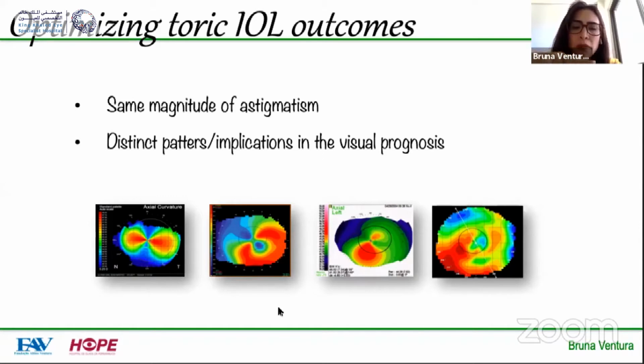We already published that it's very common for patients to have subclinical alterations in the macula that could later compromise the vision, or could have made you choose a different IOL. And if you only find that alteration after surgery, you explain to the patient you didn't cause it, but for the patient, it's very, very hard to understand that it wasn't related to your surgery. So it's very important for us to have the routine of having a corneal map and a macular OCT.